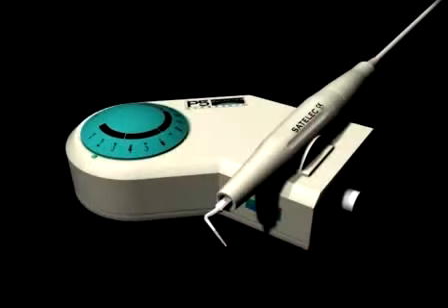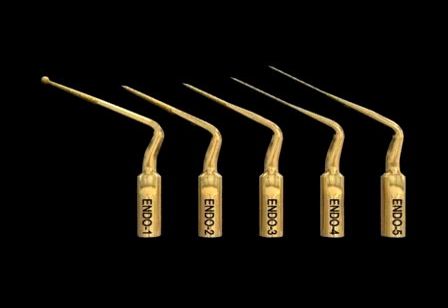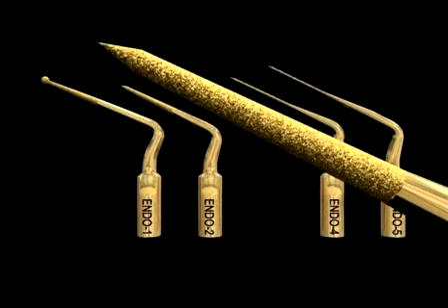Ultrasonics is playing an increasingly larger role in the field of endodontics. We use the P5 ultrasonic generator with specifically designed instruments to remove stones, trough for hidden orifices, chase calcified canals, and to finish the access cavity. There's a variety of different ultrasonic instruments that can be utilized with the P5. In general, these instruments are contra-angled, come in increasingly longer lengths, and narrowing cross-sectional diameters. Additionally, these instruments are coated with zirconium nitride. This abrasive allows us to precisely sand away minute amounts of dentin.